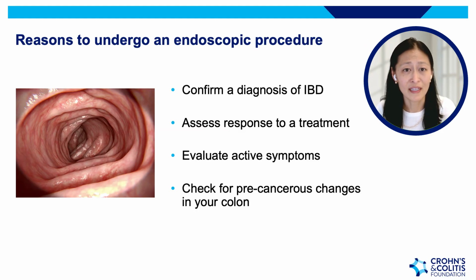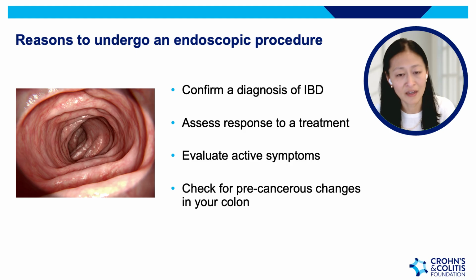There are a few reasons that your doctor may ask you to undergo an endoscopic procedure. That might be to confirm your initial diagnosis of inflammatory bowel disease, or to differentiate between Crohn's and ulcerative colitis, to assess response to a treatment that you have recently received, to evaluate any active symptoms to help differentiate between active inflammation and non-inflammation symptoms, and also to check for precancerous changes or dysplasia in your colon.